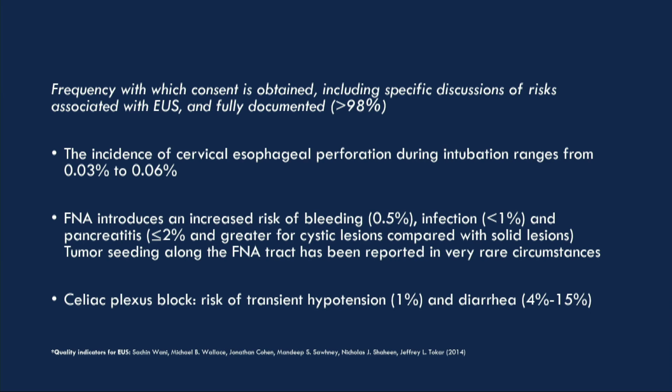Tumor seeding has been reported only in very rare circumstances, so it's very seldom. When you perform a plexus block, there can be transient hypotension and diarrhea, and of course also pain.